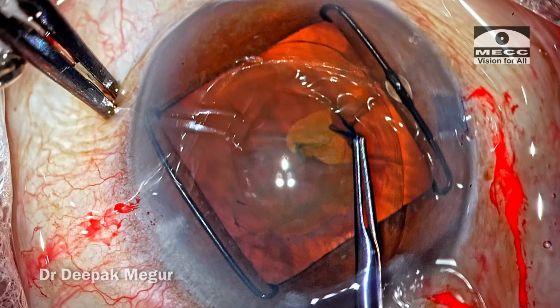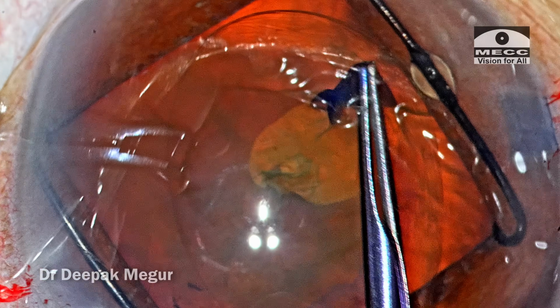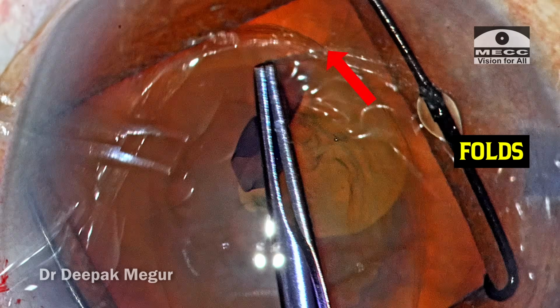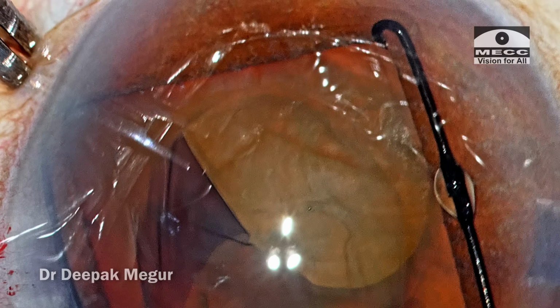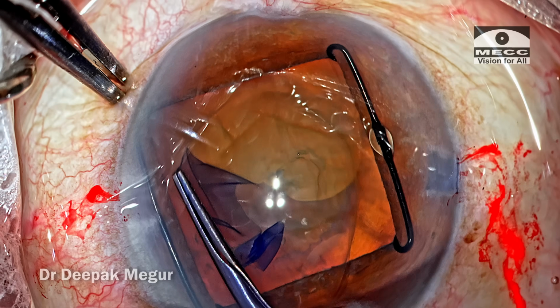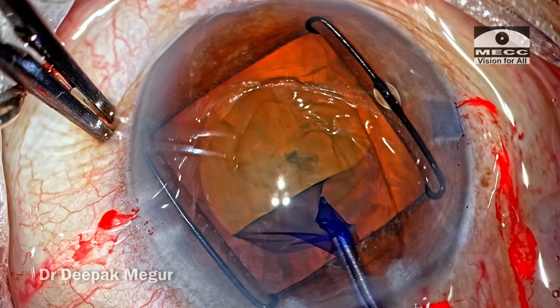The flap is raised, and as the capsule is being folded and being torn around, the highlighting feature is the folds which are just adjacent to the tearing edge. This is a classical sign of anterior zonular weakness. As the tear propagates, you can clearly see folds around the capsule. These are all suggesting zonular weakness.